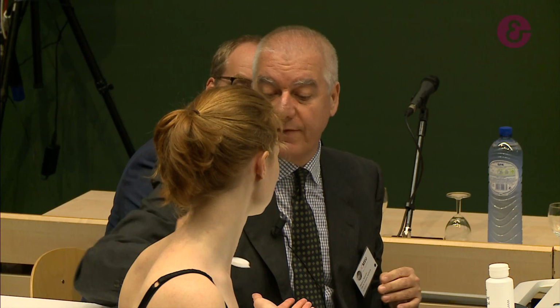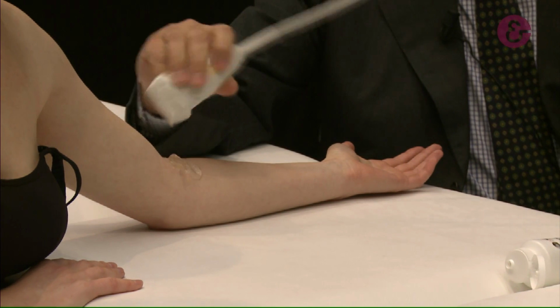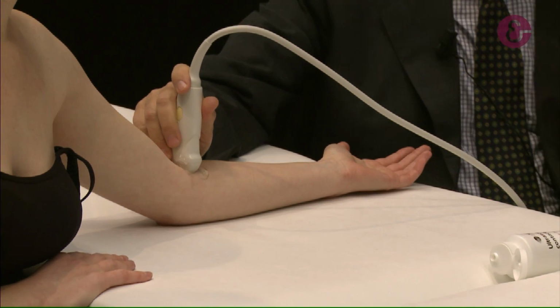From the arm, I believe the best thing is to start with the region of the elbow. At this level, you have 3 main nerves. The radial one, which is located on the radial aspect, so it's so easy.